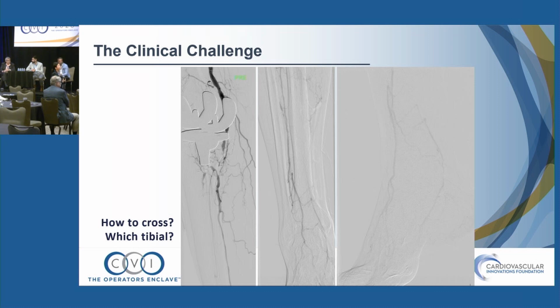Yeah, I think I probably would go DP. I'd open that AT anyway, but I'm not sure, in the angle, if that's a proximal AT, a small island of opening. Is that an AT in the left frame? Yeah, there's a small island of AT. This is one of the rare cases where you can potentially get a free shot: open that proximal portion of the pop, stabilize that peroneal, and then you could stage them and bring them back and open the AT in a separate setting. And if you're coming from above, get the sheath as far down as you can to give yourself support there.